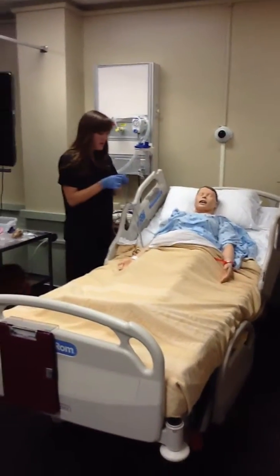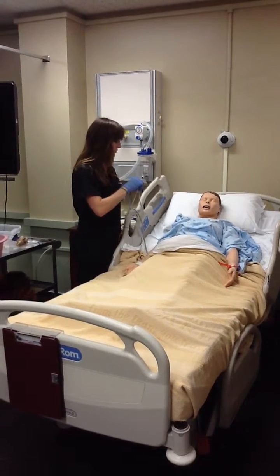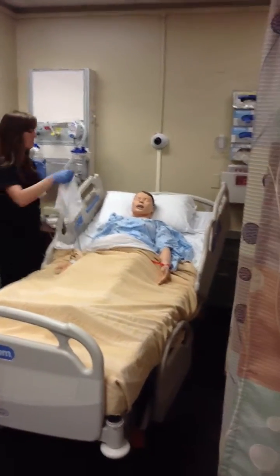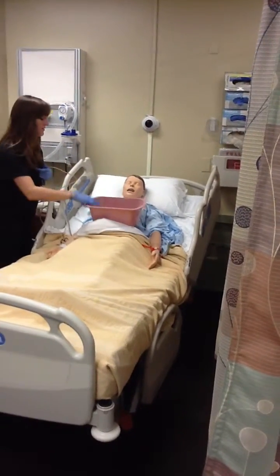Tilt your head back, and you're going to feel it when it hits the back of your throat. And if you have the urge to gag or vomit or cough, that's completely fine. I'm going to lay something over you so that if you do, we can get it cleaned up — but don't feel bad if you do.